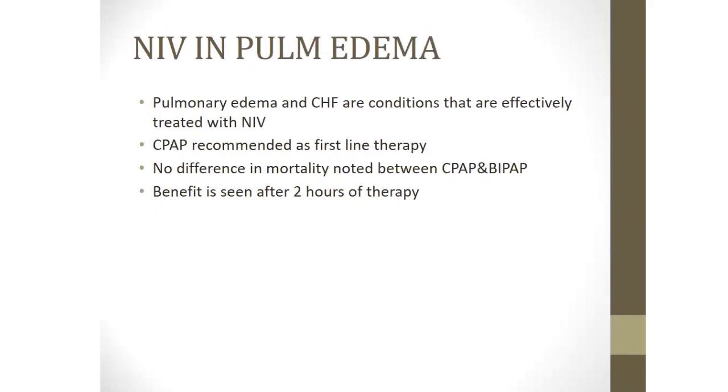Next slide, please. In pulmonary edema and congestive heart failure, whether cardiogenic or non-cardiogenic, we effectively treat with CPAP. There is no difference in mortality noted between CPAP and BiPAP. BiPAP can be used as a CPAP if I and E become equal. Benefit is seen after 2 hours of therapy.